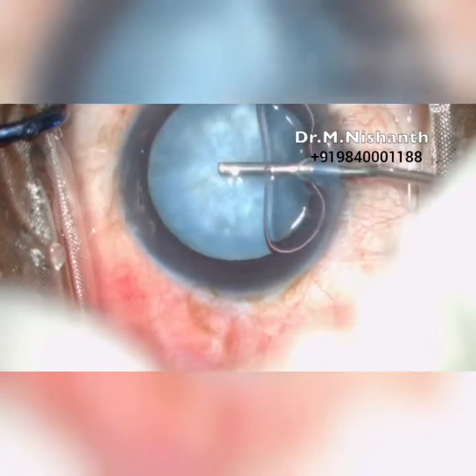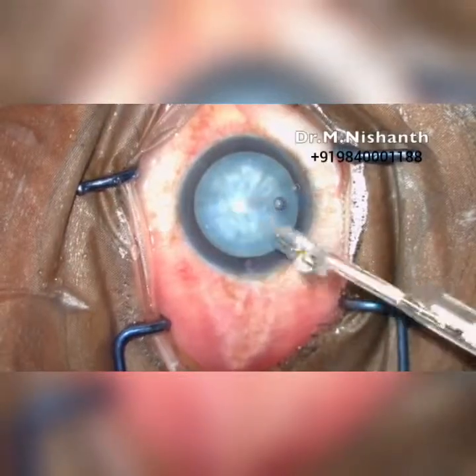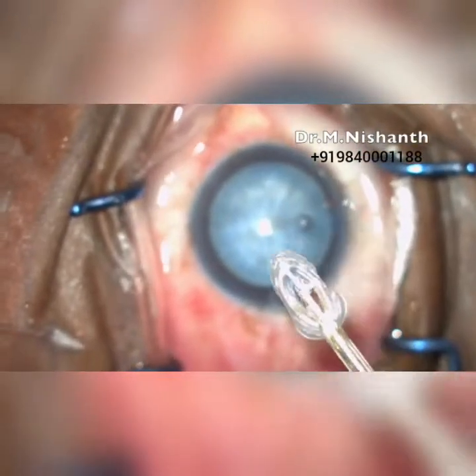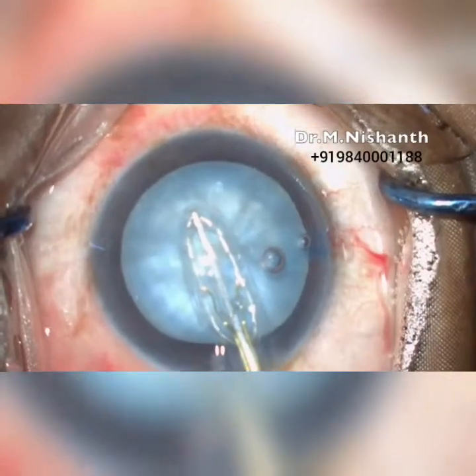After staining the capsule with Trypan blue and filling the anterior chamber with viscoelastic, we enter the anterior chamber with a 2.2 or 2.8 keratome. The zeptocapsulotomy tip can collapse to enter the primary corneal incision, then re-expand to a circle within the anterior chamber.